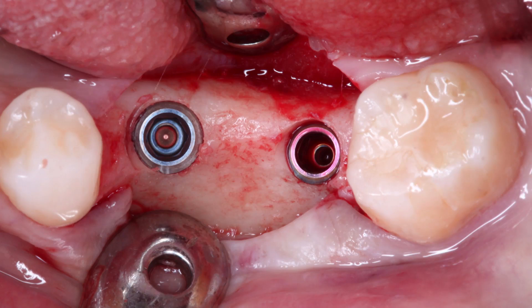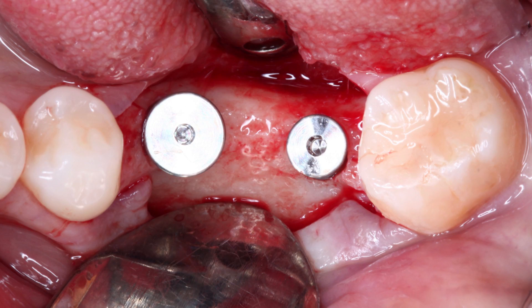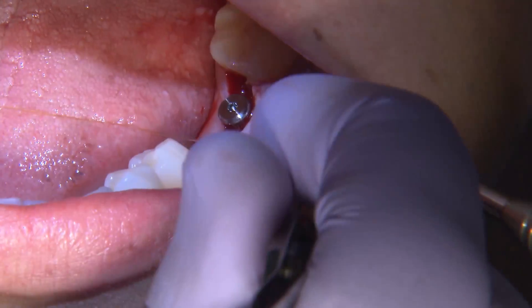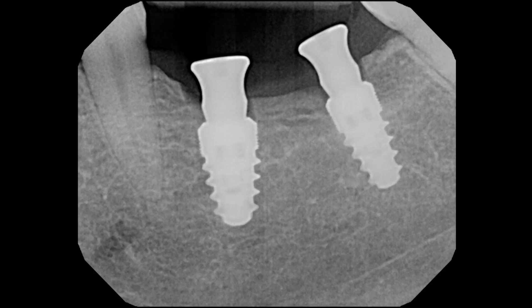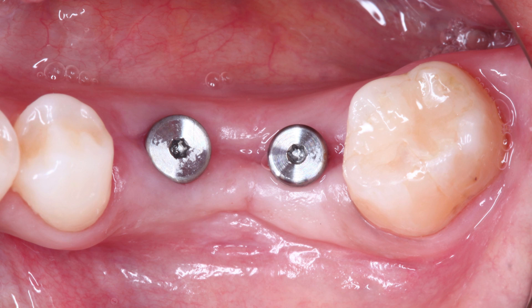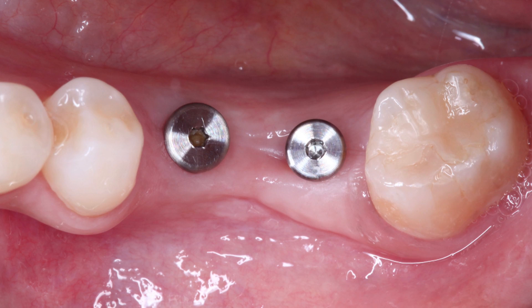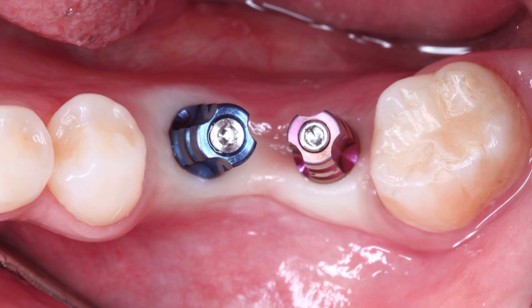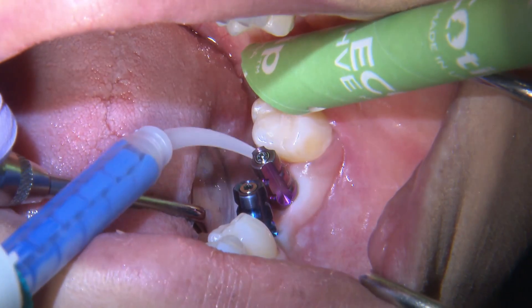We place the Han implants, remove the surgical guide, and I'm ready to place the healing abutments. I decided on a one-stage technique, placing a transmucosal healing abutment and suturing around it to close the situation and ensure good healing. One week later the patient returns for evaluation, and at two weeks we remove the sutures — the tissue is healthy. We then wait three to four months for osseointegration; in this case I waited about four months. I then remove the healing abutments and place the close tray impression copings.